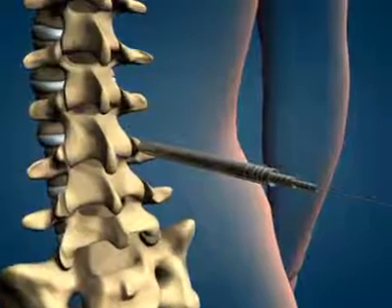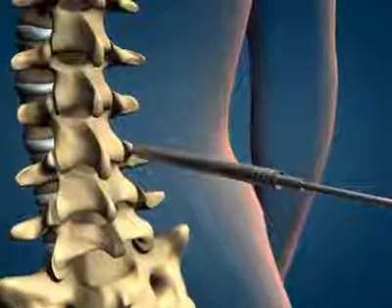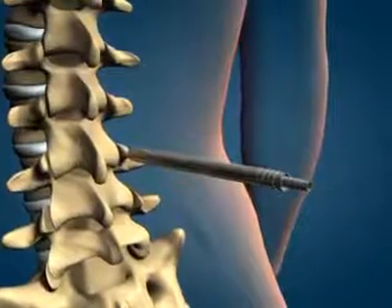Remove the guide pin and dilation tubes one and two, leaving dilation tube three in place for the remainder of the procedure.